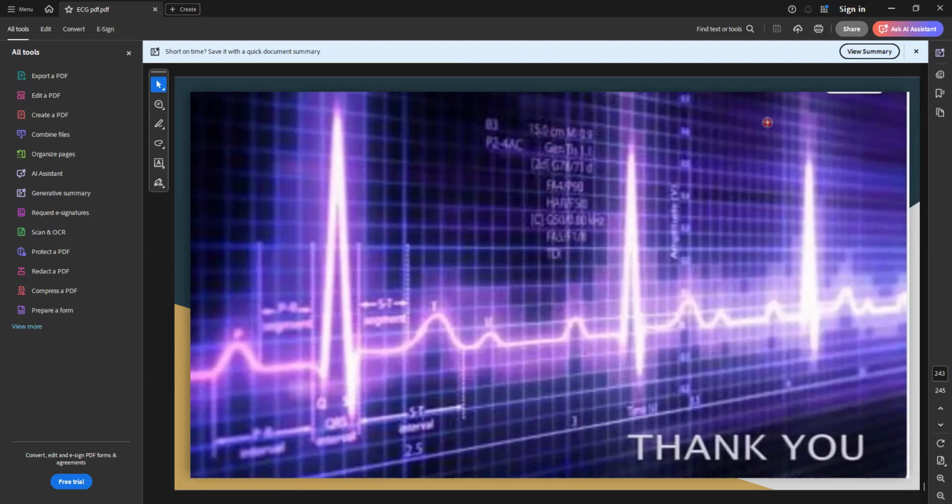There is no time for you to decide what treatment you have to give. When you see a pattern of ventricular fibrillation, what do you have to do? You have to defibrillate immediately. Otherwise, the patient may go into sudden cardiac arrest and you will lose the patient. So, MI, electrolyte imbalance, heart blocks, and arrhythmias. Commonly you will come across these patients.